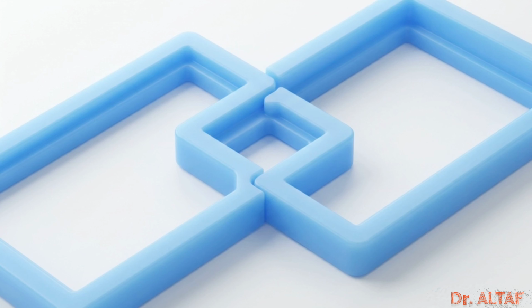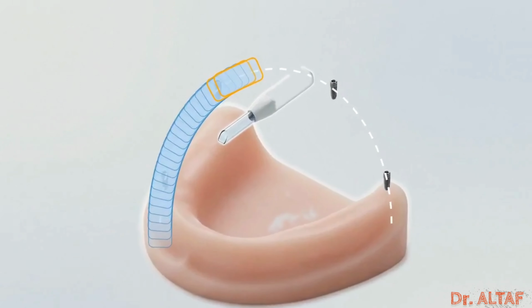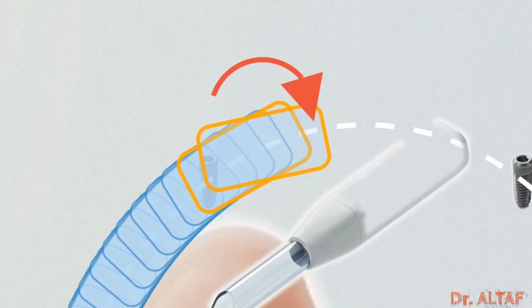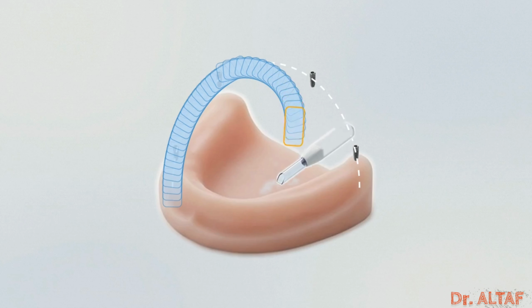As the field of view moves across an edentulous arch, the software stitches the frames together to build a continuous map. This algorithm requires distinct anatomical landmarks, but healed gums are featureless. Without sharp landmarks, the stitching algorithm slips, slightly misaligning each new frame. On an individual frame, the error is microscopic. But as the scanner traverses the entire arch, those tiny misalignments compound.